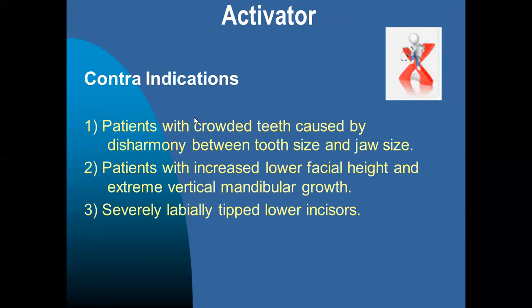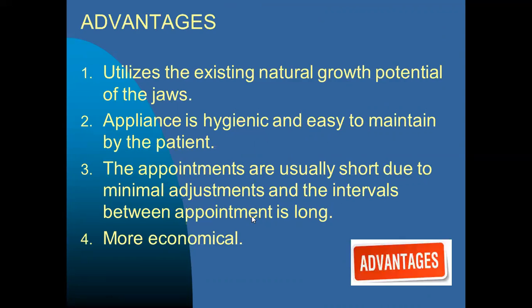Contraindications of the Activator include patients with crowded teeth caused by disharmony between the tooth size and jaw size, patients with increased lower facial height and extreme vertical mandibular growth pattern, and severe proclination of the lower incisors.